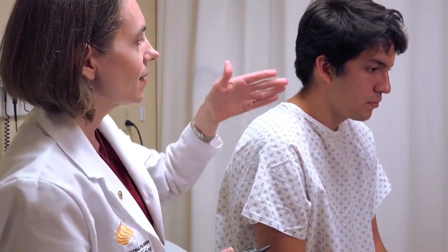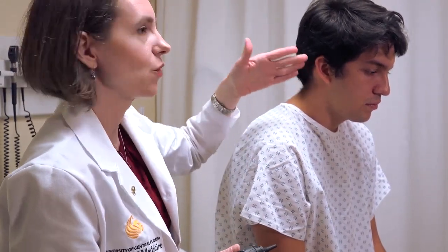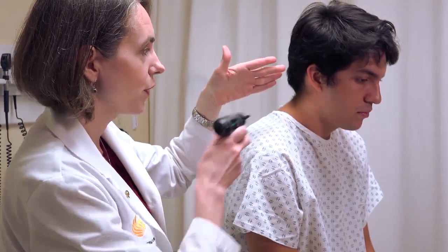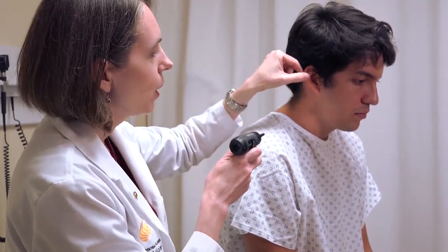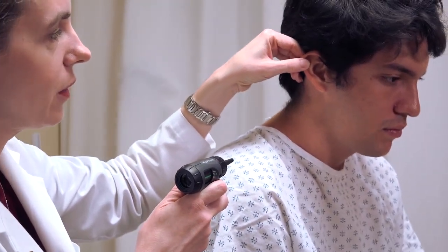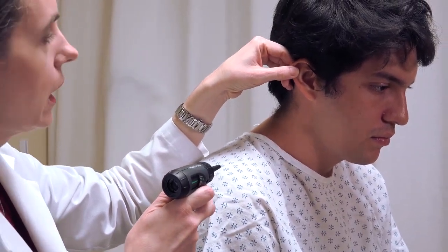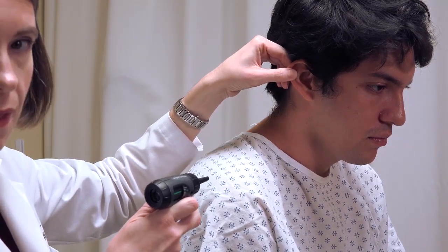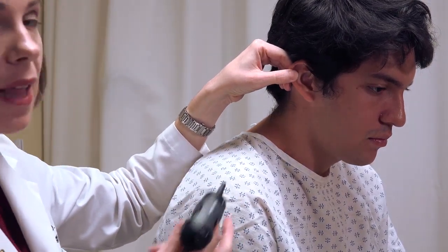When you go to actually insert the otoscope into the patient's ear, the ear canal and the pinna are not necessarily lined up in a straight line. To line everything up so we can fit the otoscope in and see the eardrum, we want to pull the pinna gently superiorly and posteriorly. This is not a large movement — it's a subtle movement in that direction — and that helps line everything up.